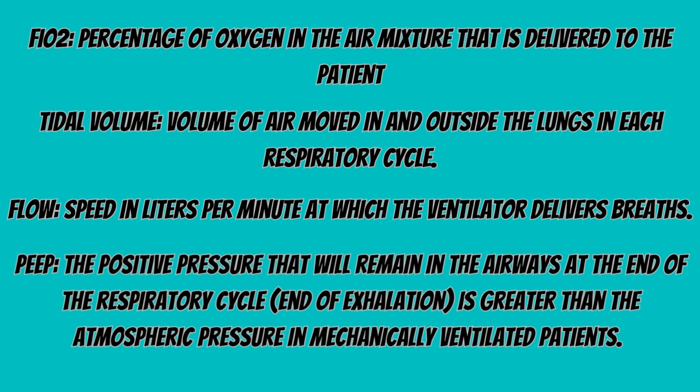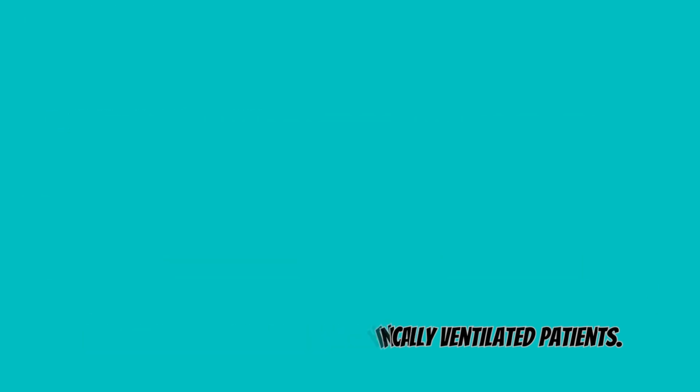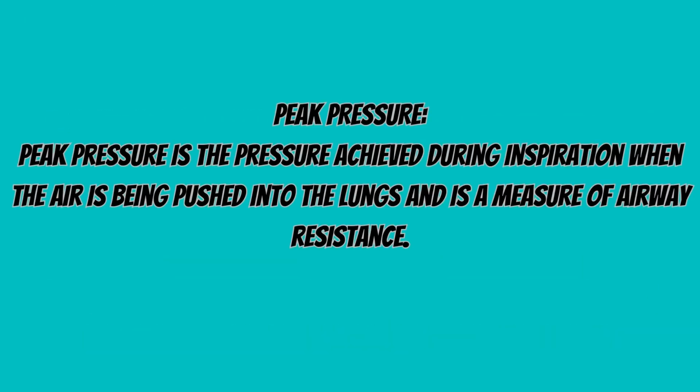PEEP: the positive pressure that will remain in the airways at the end of the respiratory cycle, that is at the end of exhalation. Peak pressure is the pressure achieved during inspiration when the air is being pushed into the lungs and is a measure of airway resistance.